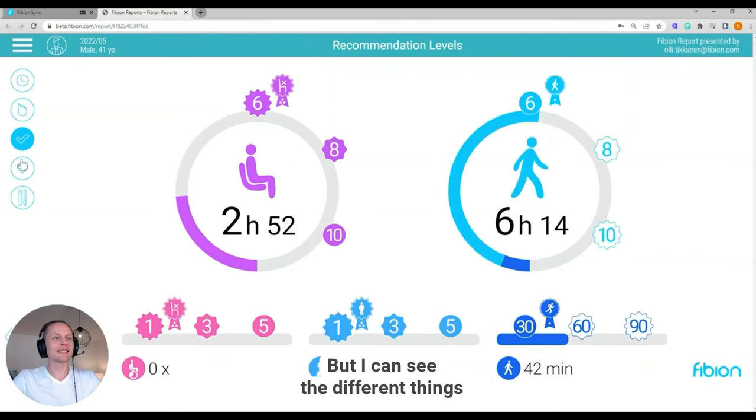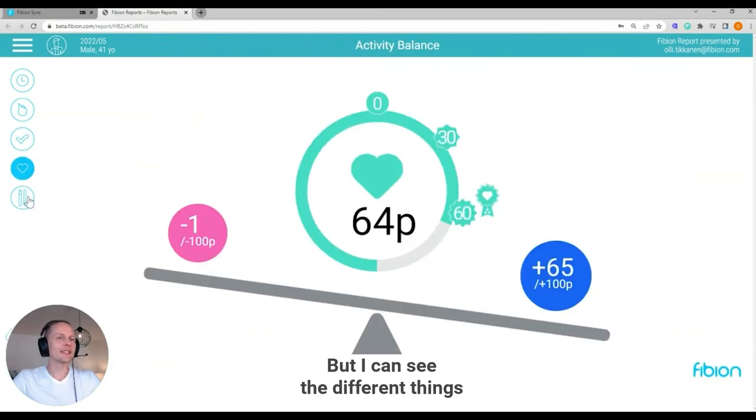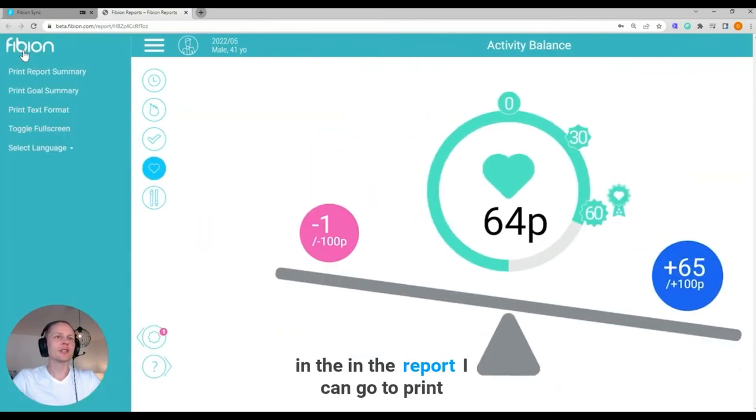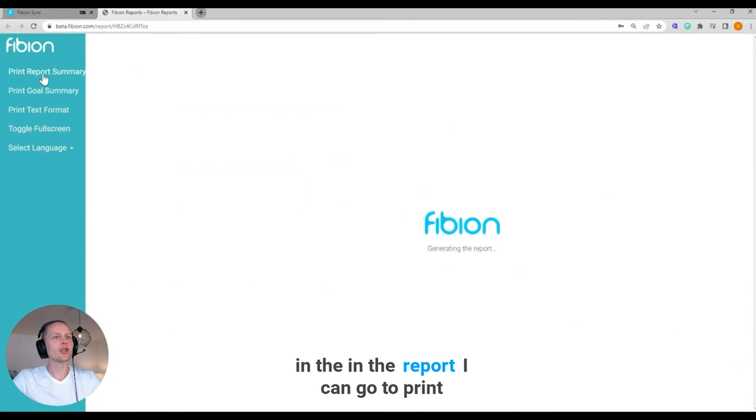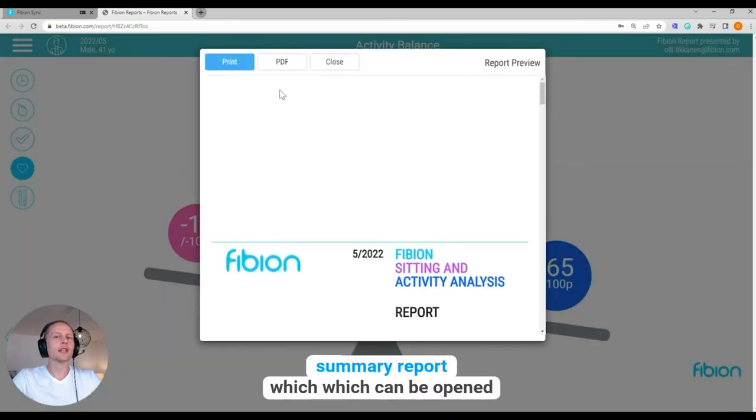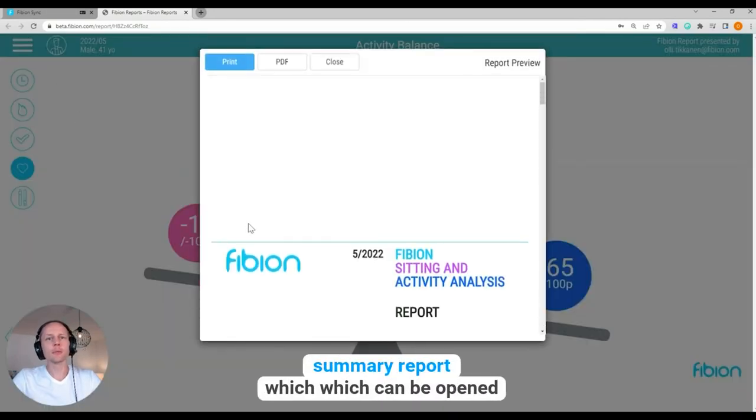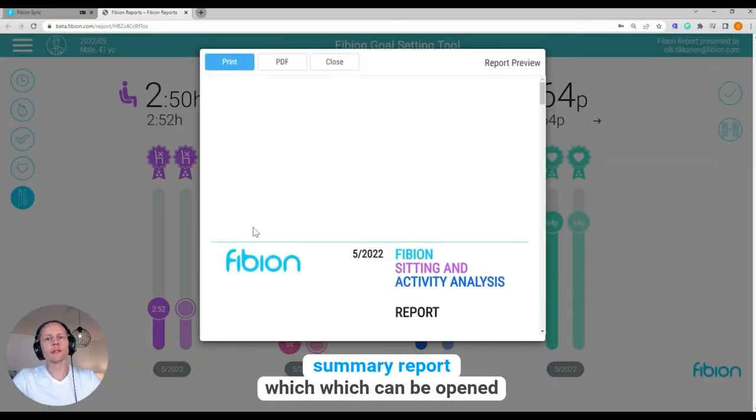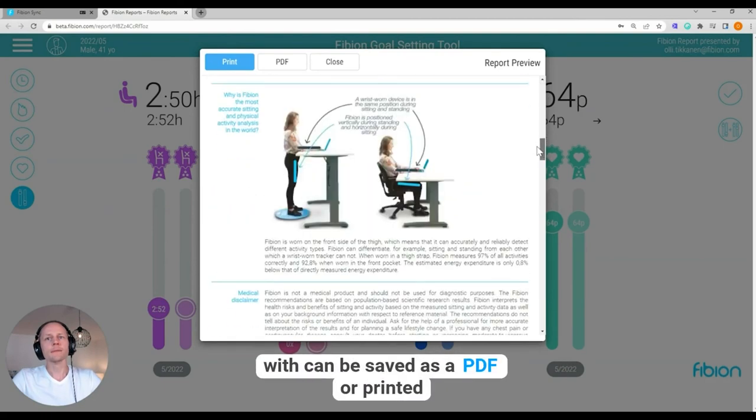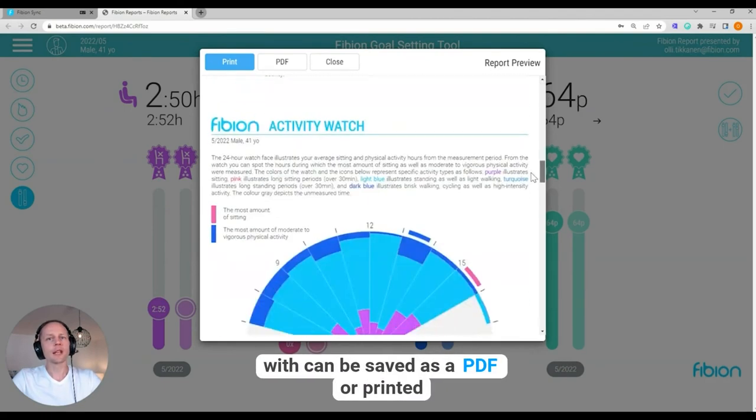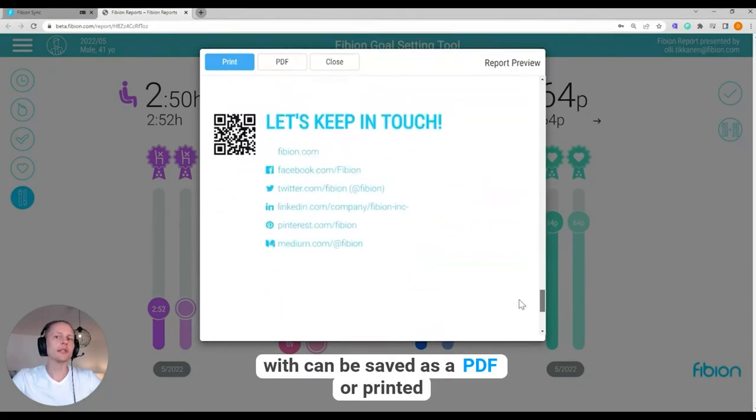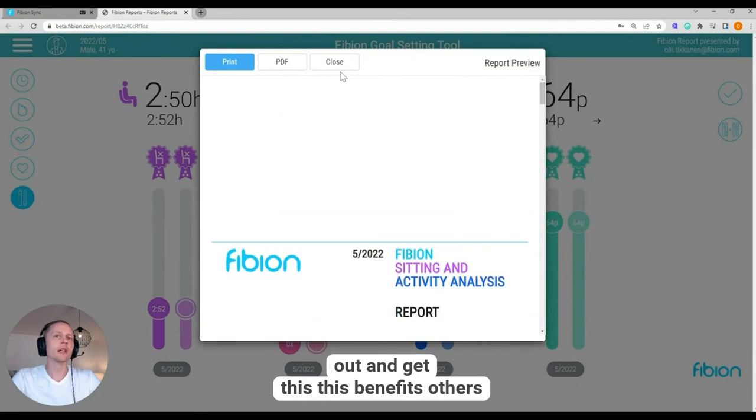I can go to print a summary report, which can be opened, which can be saved as a PDF or printed out.